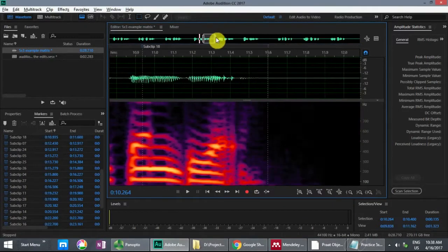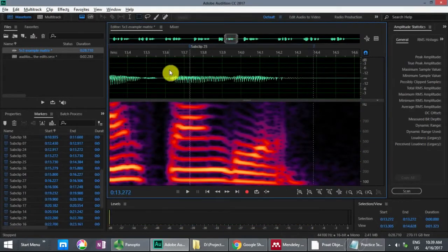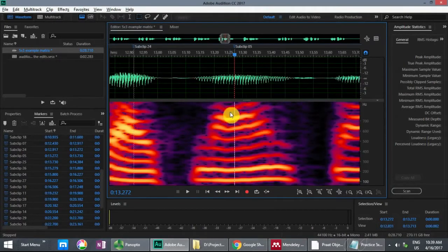So let's go to number 5. 9 strong. Okay. 9. All right, so let's take a good look at that.